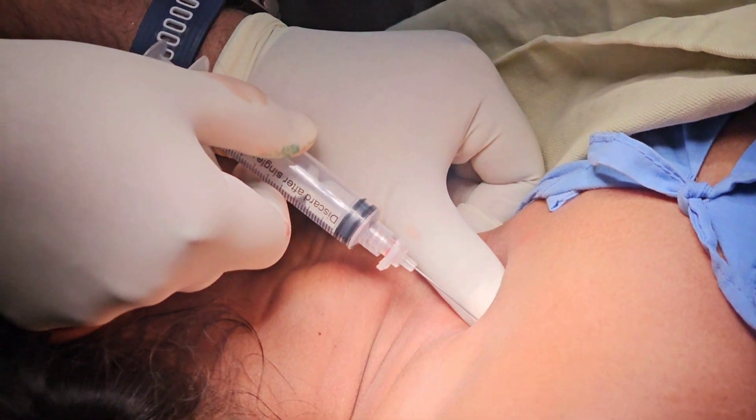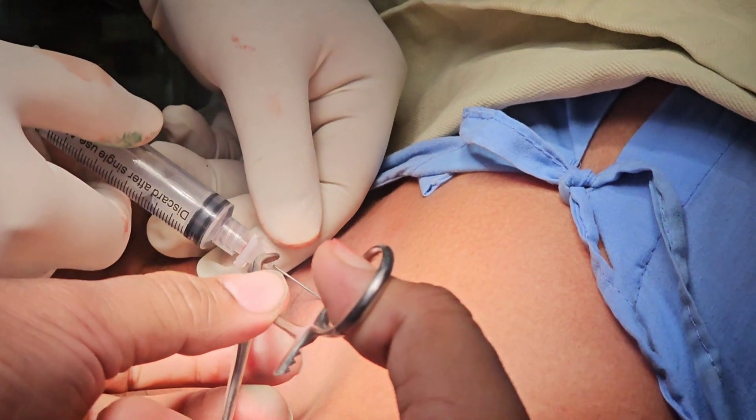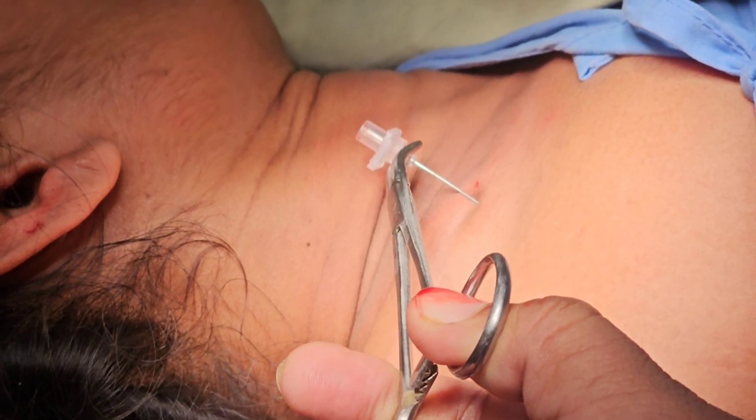This patient was given a supraclavicular approach of brachial plexus block for a fracture in the shaft of the ulna. Here we use the landmark technique, and the landmarks were the medial head and the lateral head of the sternocleidomastoid.